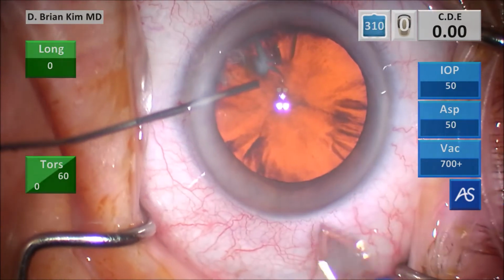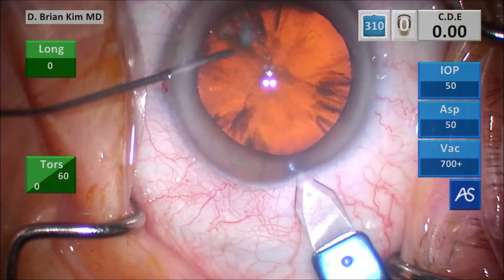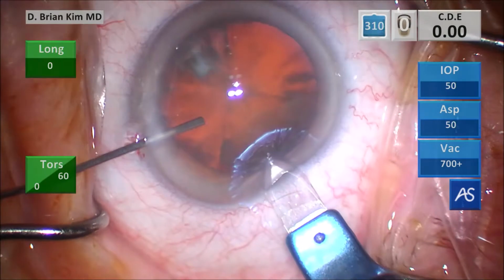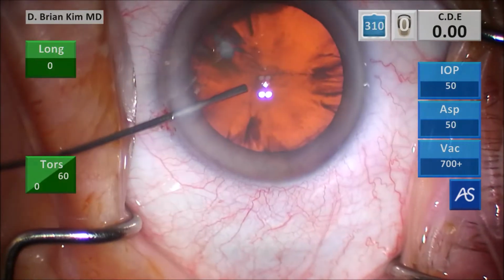This is the triplanar corneal incision. I make a vertical groove, place the blade into the deep part of the groove, tunnel through the cornea, and when I'm ready, I use a cannula to turn the eye towards me, and then I enter. Inject some more viscoelastic at the end here.